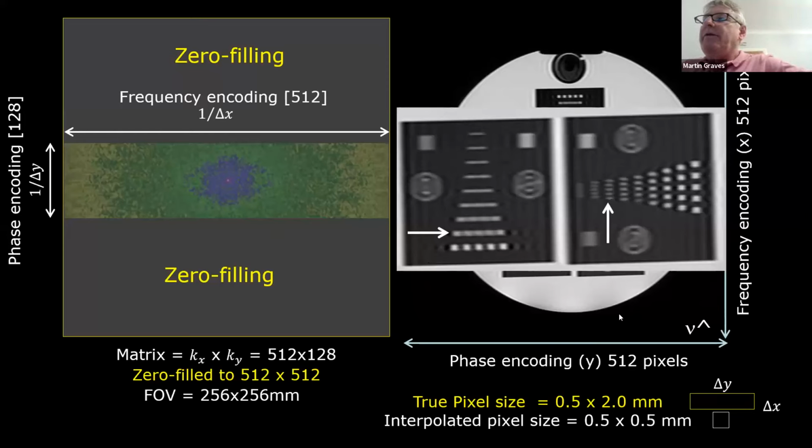Okay, thank you again. So it's important to understand the differences between the true pixel size and the interpolated pixel size. Again, that may be quite important in coming to your diagnoses, and particularly if you're using small fields of view or require high resolution for pediatric studies.